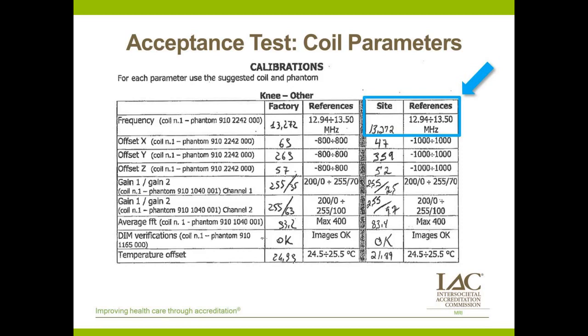That's not something you're going to see in every report, but I wanted to point it out because it's interesting and unusual. But the main thing here is to say for every one of these lines on a report like this, I would be able to look down the right-hand column and say, okay, there's the acceptable range, and there is the actual number, and yes, it falls right into that range, so it's a pass, no question, no argument. Clearly it was done. These are realistic numbers. These are not just made up.